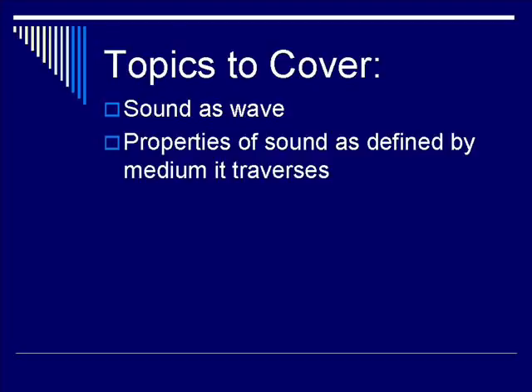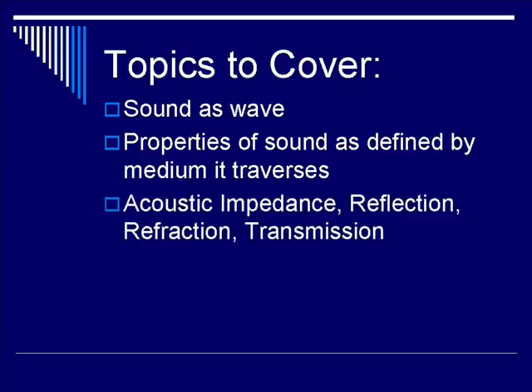Many of the properties of sound, such as amplitude, frequency, etc., are determined primarily by the properties of the medium it traverses, such as material properties in the form of density and acoustic impedance. Acoustic impedance, in turn, has significance in determining the reflection and the transmission of the initial ultrasound wave. Refraction of ultrasound against an interface is also very important and will be discussed.